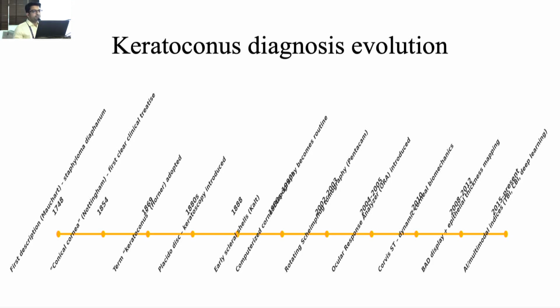So in the diagnosis evolution, from the first description of staphyloma diaphanum, we have moved across to the Placido disc methods, to the computerized Scheimpflug imaging, to the Corvis ST displays, and finally to the new era of AI and multimodal imaging in 2015 onwards.